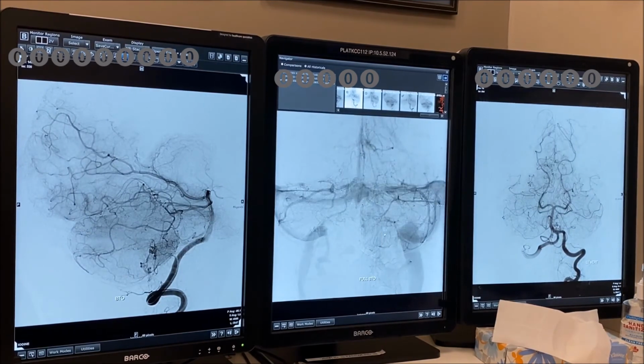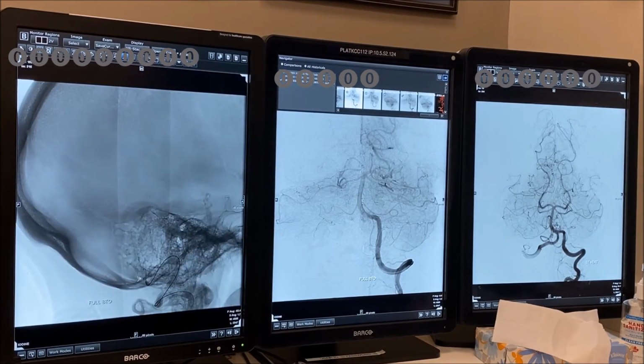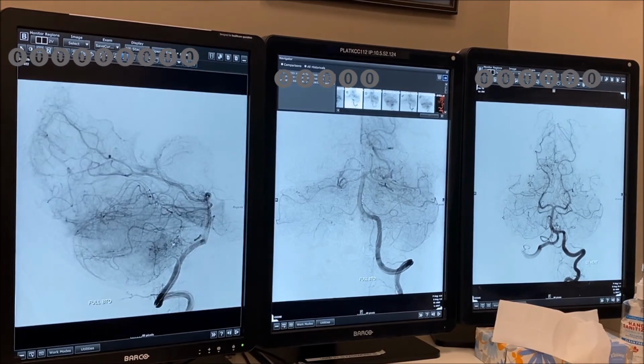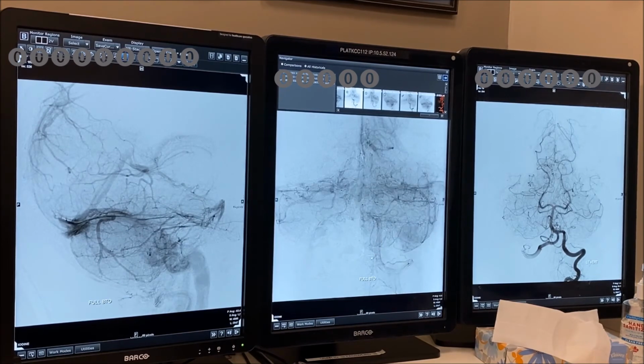Yeah, this is well inflated. Okay, this is going to be here. The balloon is inflated there. Okay, so now we don't feel anything. However, there are some collaterals that come into some of this. Right? This is part of the complex.